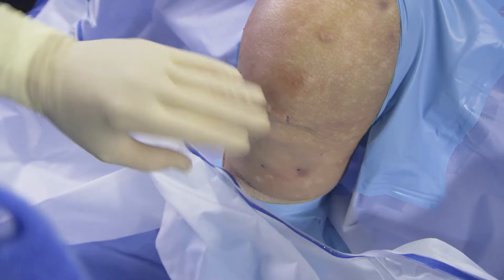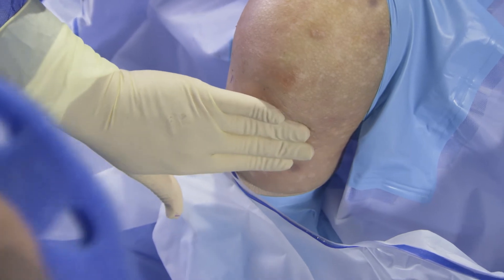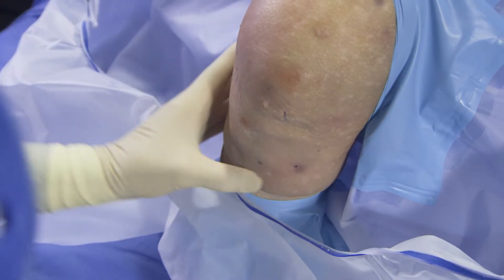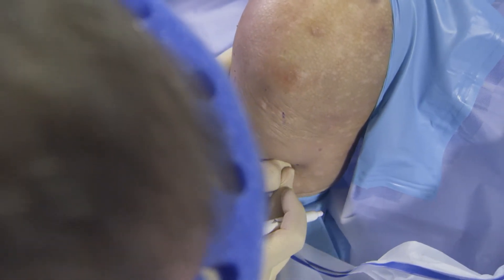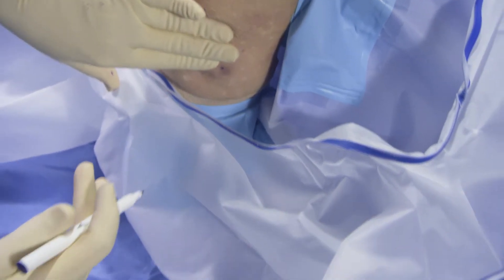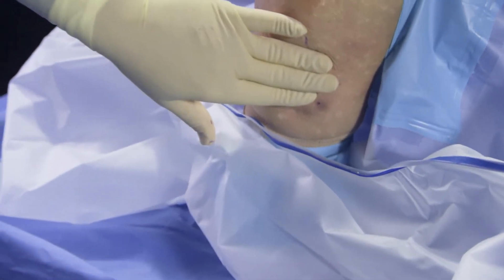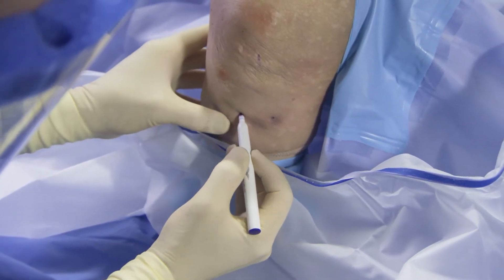Normally the patient would be positioned at about 80 to 90 degrees of knee flexion. Landmarks used are the top of the tibial plateau, typically about three finger-breadths below that. The choice of incision can be either vertical or oblique. I prefer oblique because it follows the direction of the tendon and allows easier harvest in my experience.